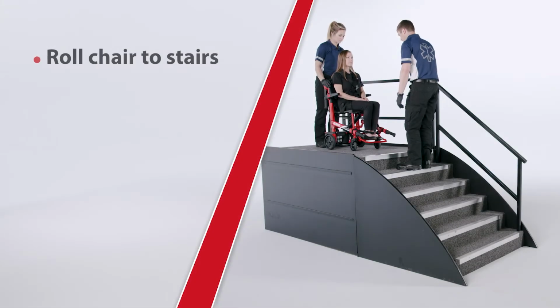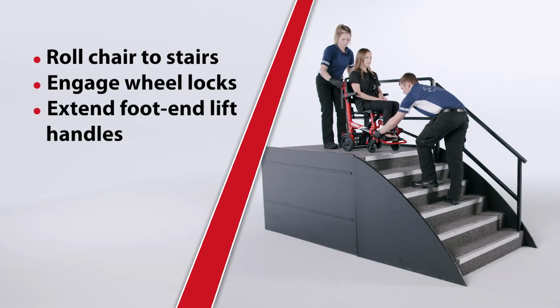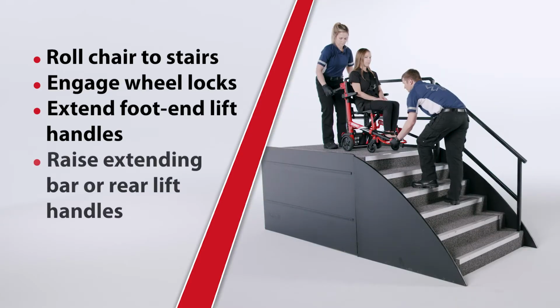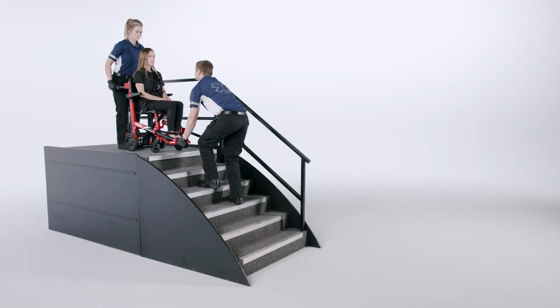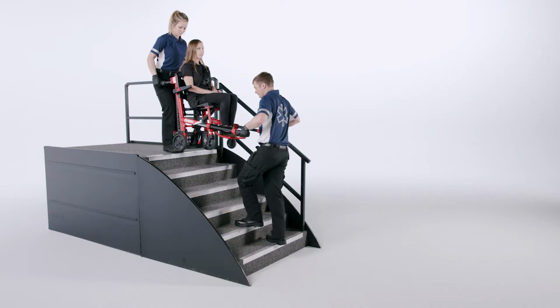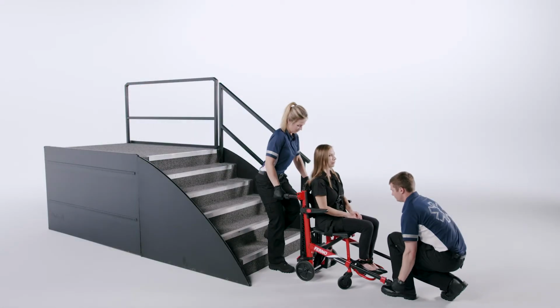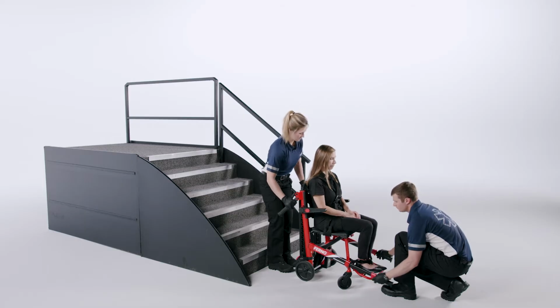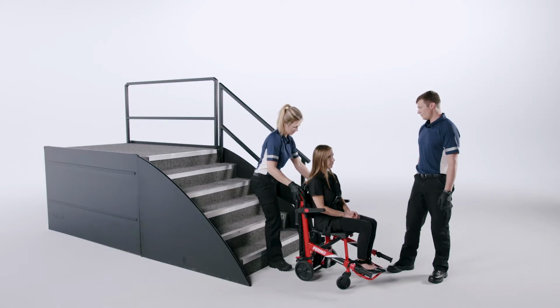Roll the chair to the stairs and engage the wheel locks. Extend the foot end lift handles. Raise the extending lift bar or rear lift handles if present. Working together, lift the chair and carry it down the stairs. The spotter, if available, keeps a hand on the foot end operator's back and provides verbal guidance. At the bottom of the stairs, set the chair down, retract the lift handles, and adjust the lift bar if present.